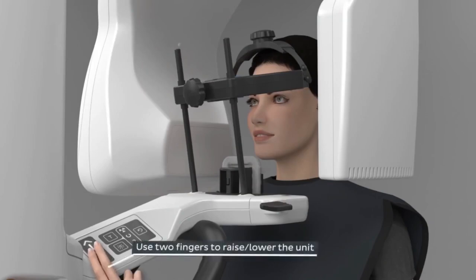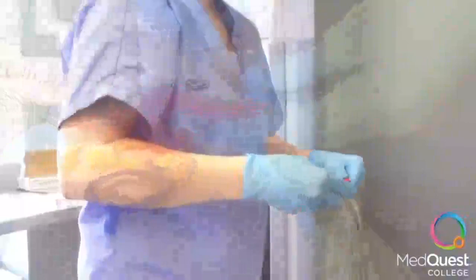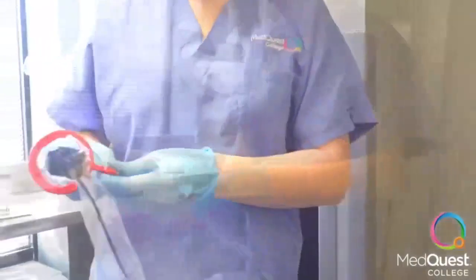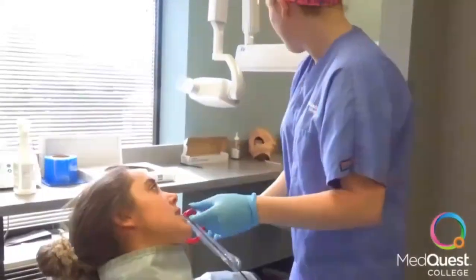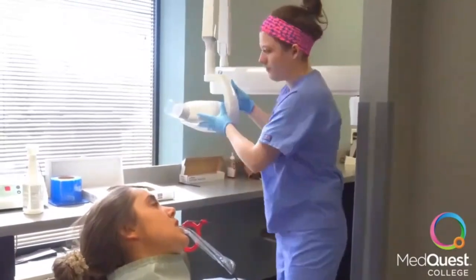Let's look into different types of dental X-ray techniques. First, let's learn about the bite wing X-ray. Bite wing X-rays are incredibly common and are often taken for preventative purposes because they are a great way to see any decay between teeth or below the gum line. The term bite wing comes from how patients must bite down on the X-ray film. These types of X-rays can be taken right in the dental chair.